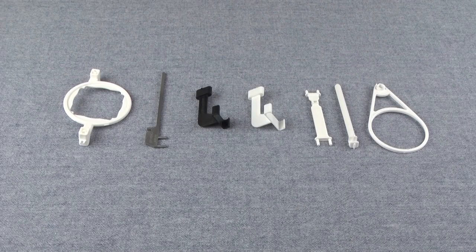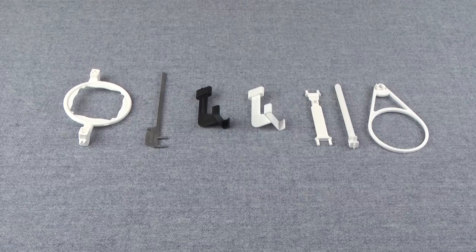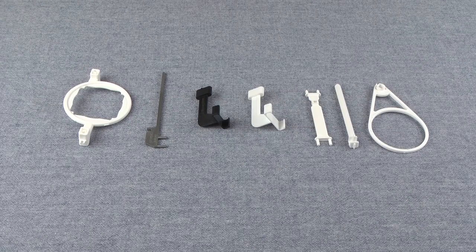Hi, Sandra here with another XDR Clinical Minute. This is part 3 of our series on the XDR Holder Kit. In this video, I'll be demonstrating how to assemble a horizontal bite wing holder.